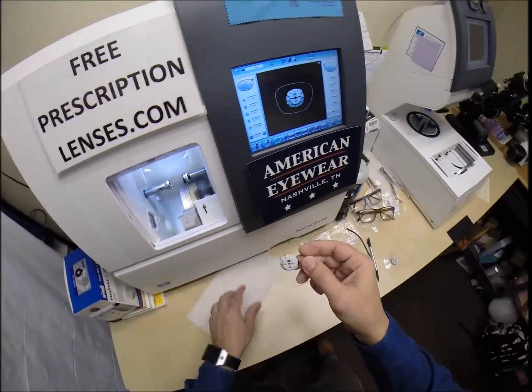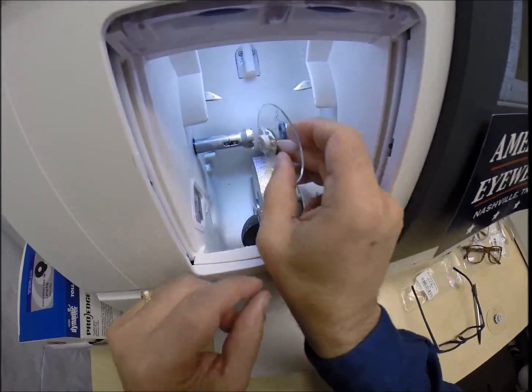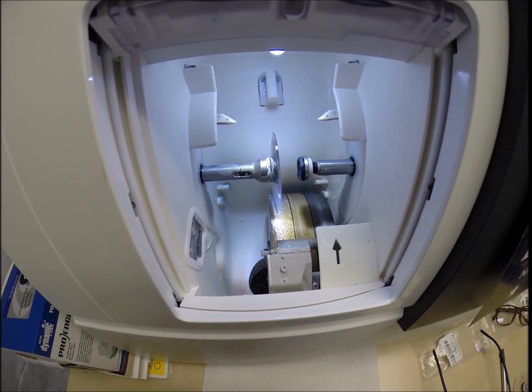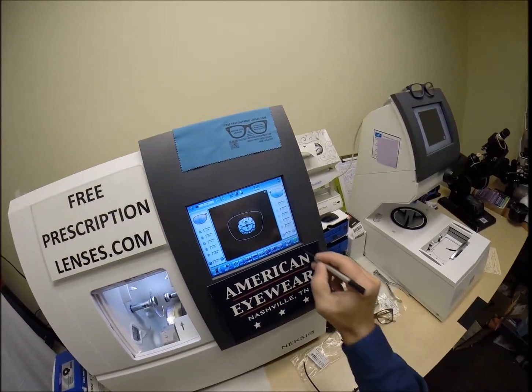I'm going to go ahead and let the magnet do its job a second time today. It's going to attach itself to another magnet there in the chuck, or as I like to call it, the Charles, because I don't know this machine well enough yet to call it Chuck. That's right, more bad jokes with every pair of glasses sold.